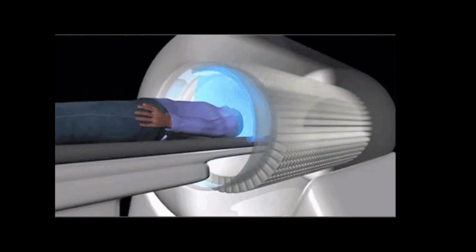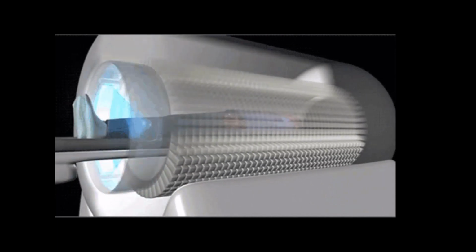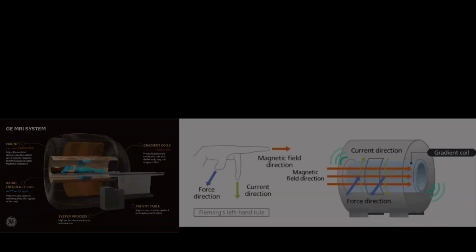The patient lies inside the magnet and their whole body is magnetized to one specific level. In other words, all the hydrogen atoms are at the same magnetization.